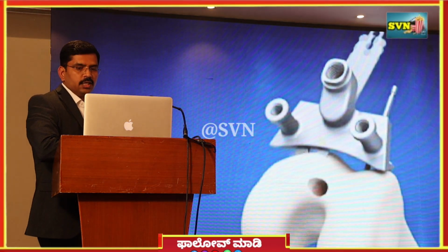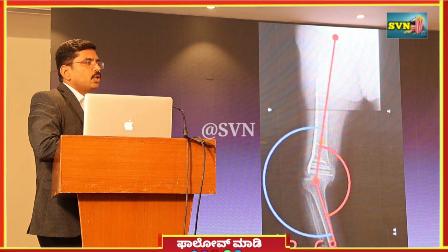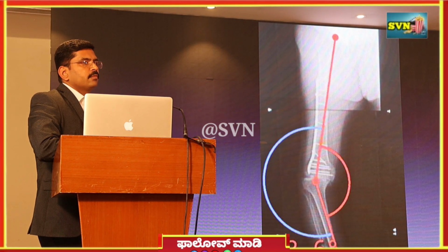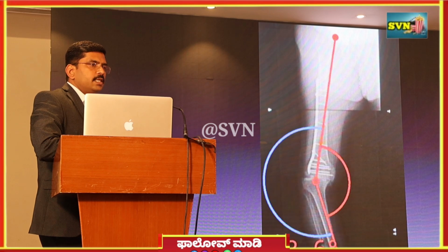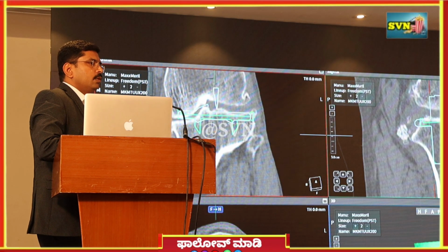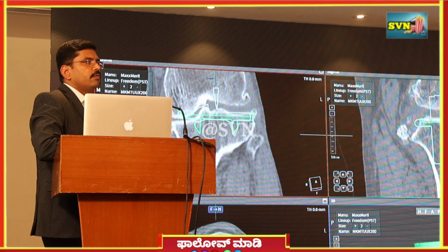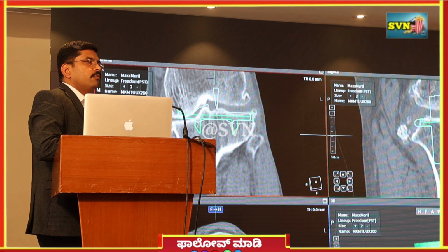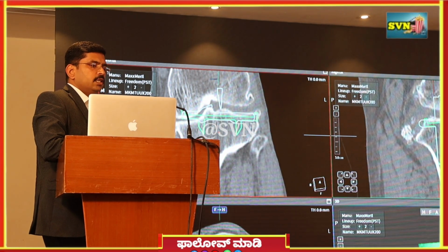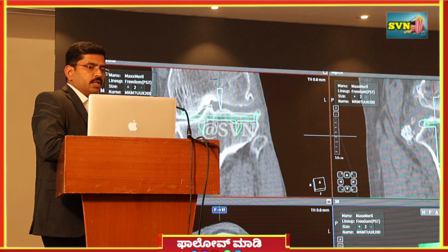So how do we do that? We take the planning preoperatively. This planning would show us what is the angle of deformity. The same thing is confirmed with the CT scan, and on the 3D model, we understand where exactly we place the implant, where all the screws can come in position, which implant needs to be removed, which can be left inside. And once that planning is done, we exactly know where the implant sits and what is the millimeter of bone that we will be taking out.